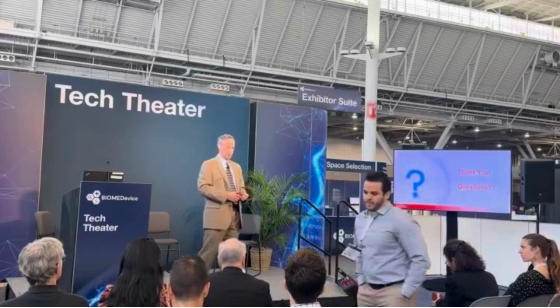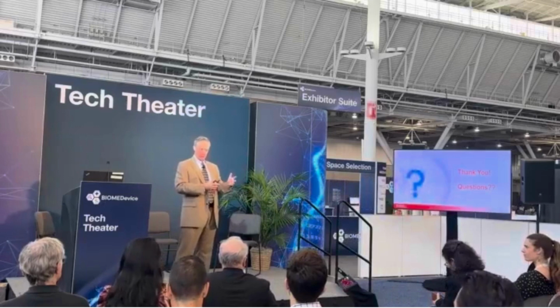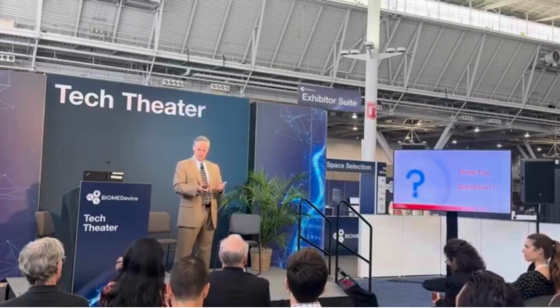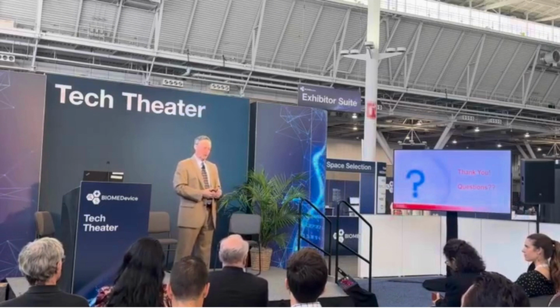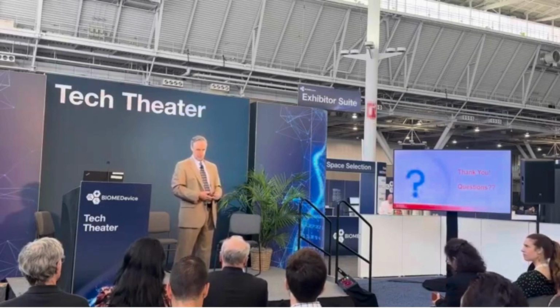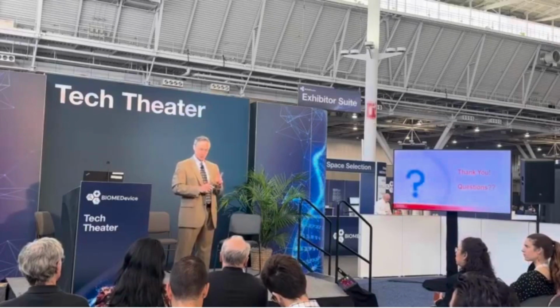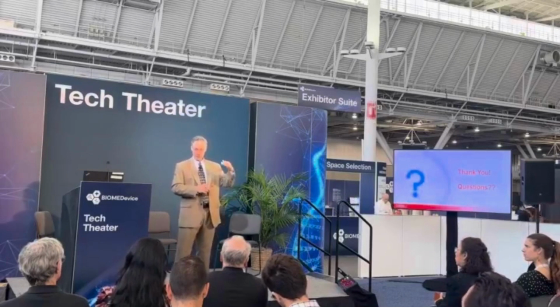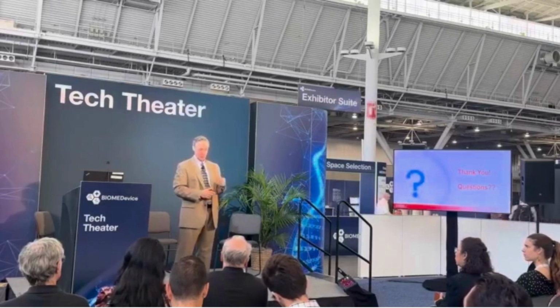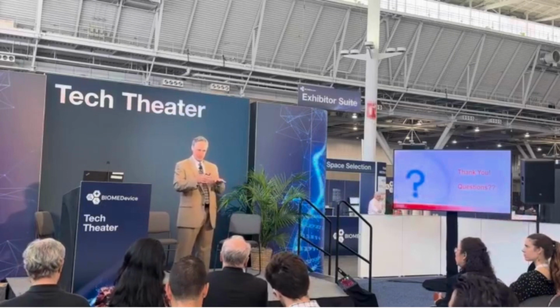Excellent question. This is the first question. The question was, how is visualization achieved effectively in arthroscopy? One thing that I forgot to talk about, I'm glad you asked that question, is a thing called fluid management. There's saline that flows in and out of the joint space, and that does two things. One is it equalizes with the blood pressure to keep any blood out of the visual field, and two, it removes debris that gets in the way as you're accessing the space and moving tissues around.